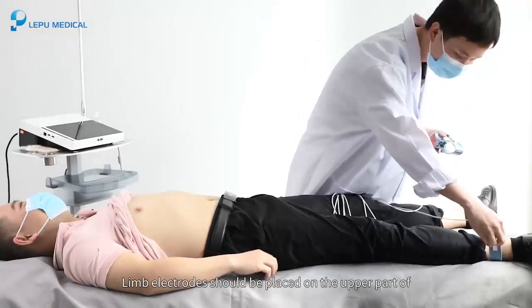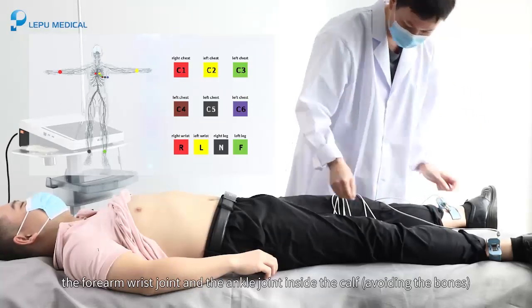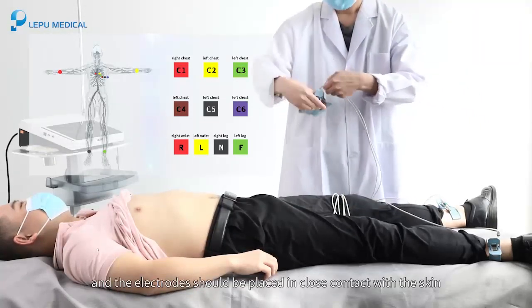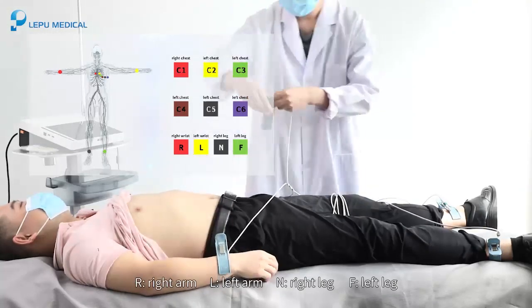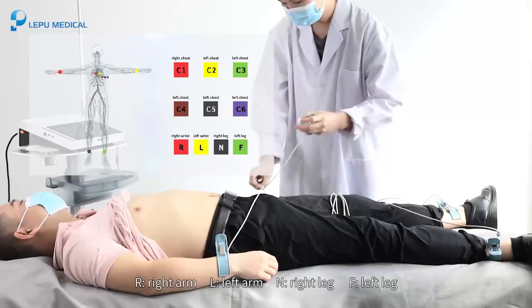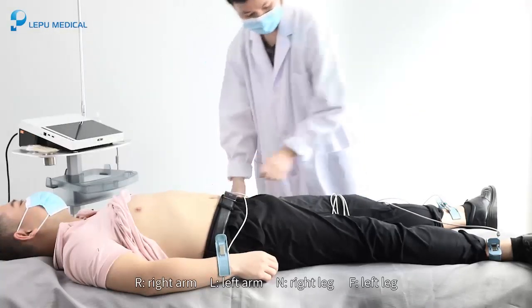Limb electrodes should be placed on the upper part of the forearm wrist joint and the ankle joint inside the calf, avoiding the bones, and the electrodes should be placed in close contact with the skin. R: Right arm. L: Left arm. N: Right leg. F: Left leg.